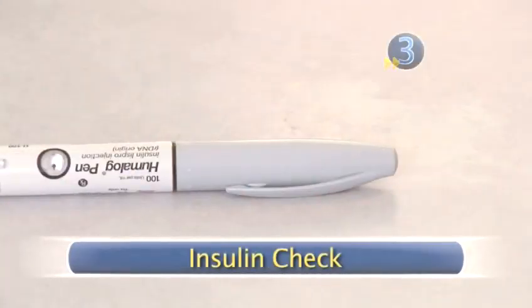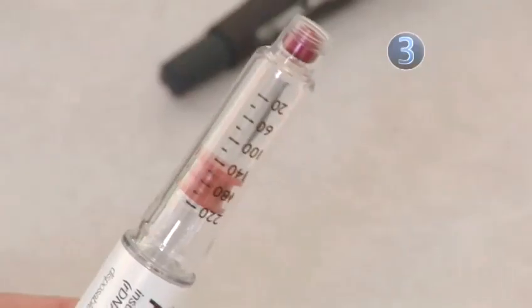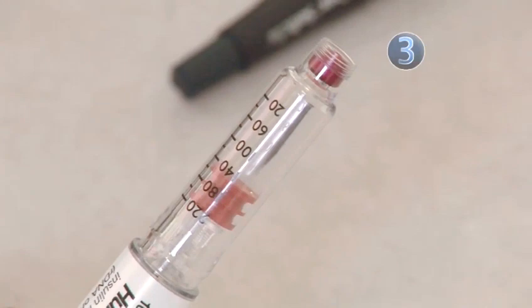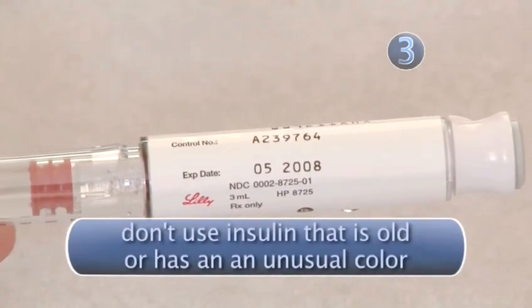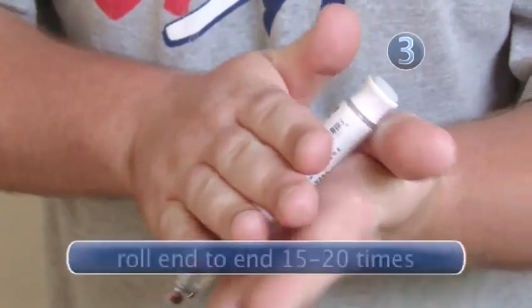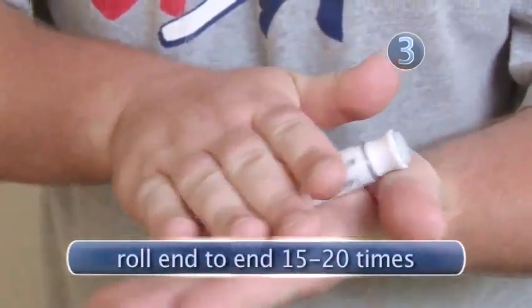Step 3. Check your insulin. Be sure to learn the proper color and consistency of your specific insulin, and check the expiration date. If you're using cloudy insulin, mix by gently rolling the pen between your hands 15 to 20 times.